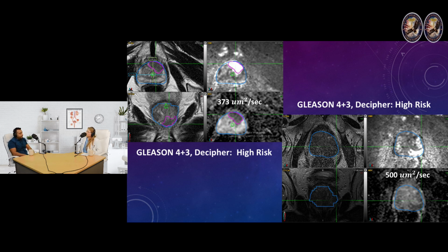And tell us about the non-ferrous materials used to build these Faraday cages. Most of the time it's copper, which I think might be the cheapest, or aluminum. Usually they have these copper or aluminum shielded cages built into the walls, and that basically blocks every electromagnetic wave from the outside, so you can have pure readings on the MRI scanner. Exactly. So we were wondering about that on this particular T2 weighted image, just from the noise.